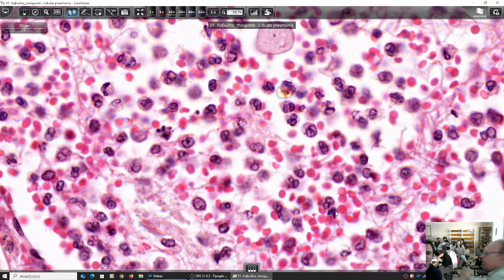It's easy. The ones where the nucleus is not round, but has some sort of lobulation. Maybe. So with the mice? This, maybe. Right. And this one, you see, this one is round. You see here, this one? This one is round. This one isn't round. So this is a neutrophil. This one? Round. This is a mononuclear cell, probably a macrophage. This is a macrophage. You see that it has cytoplasm because of phagocytosis.